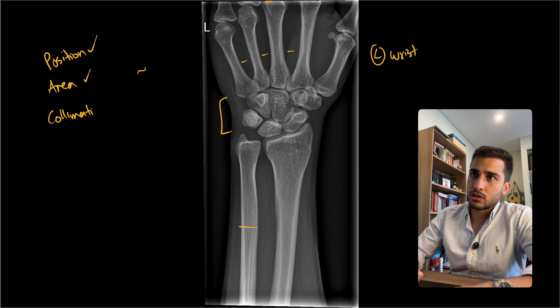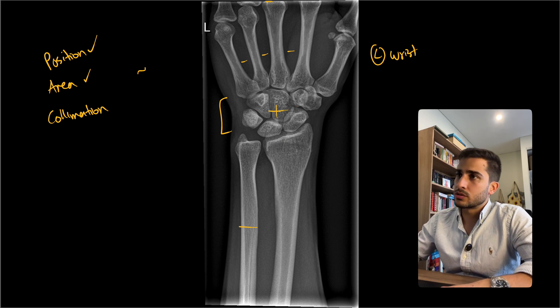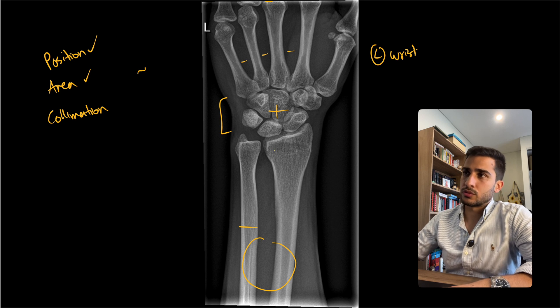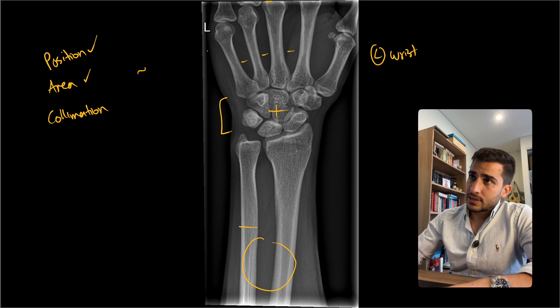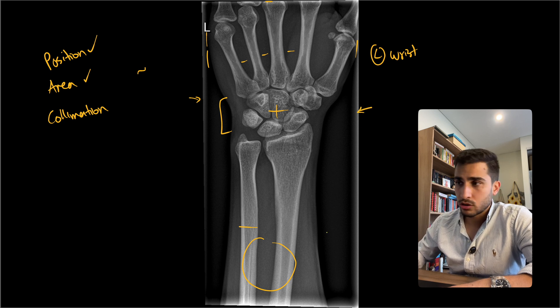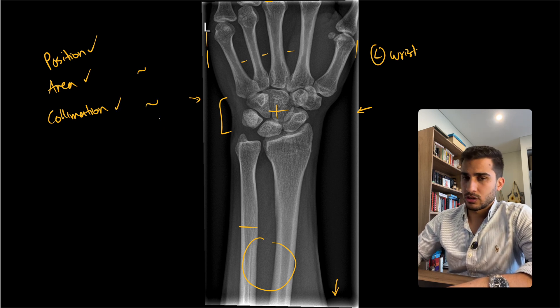Next is collimation. The center of the wrist joint should be at the carpal bones, but in this case it seems like it's including a little bit more of the radius and ulna, potentially because that's where the pain was. So centering could be improved and therefore the collimation could have been improved as well. On the sides, however, it's quite tight. We can see that silver lining effect on all four corners, which means this was the actual collimation used and not post-processed.